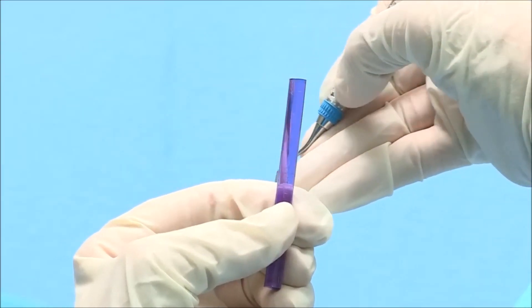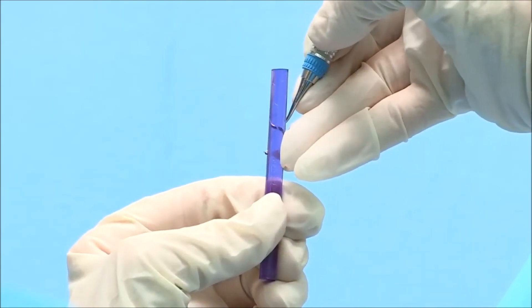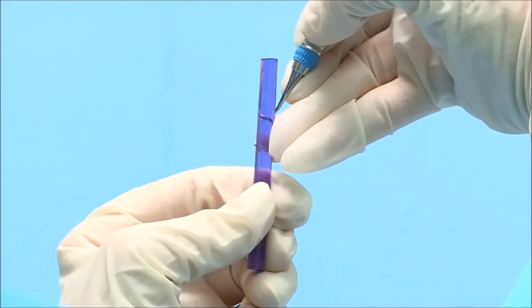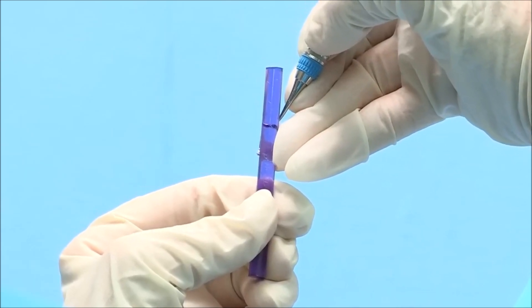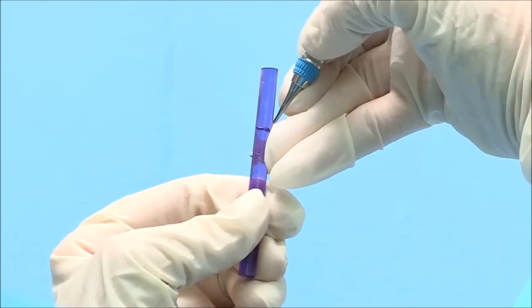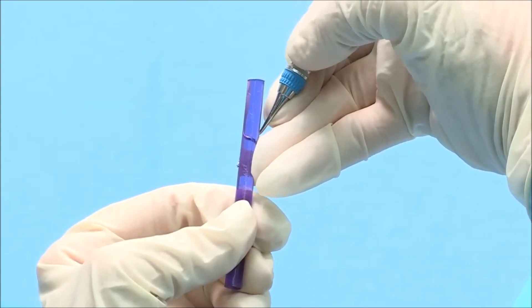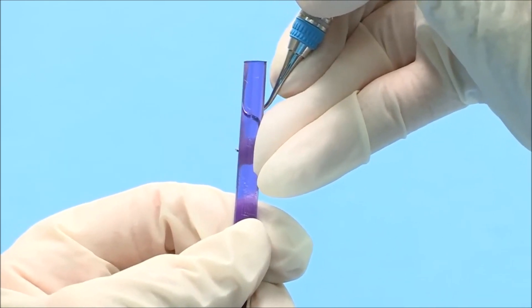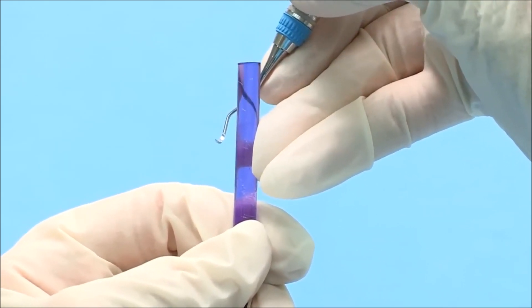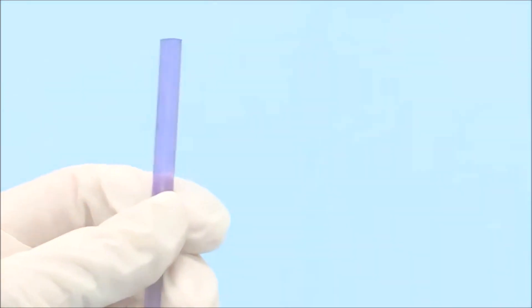Bring the instrument behind the test stick and place the cutting edge against the left side of the stick. Place your ring finger against the side of the test stick opposite the cutting edge to act as a fulcrum while testing. Press the cutting edge into the test stick and release. If the instrument is sharp, it will bite or grab the test stick. You will also hear a metallic sound or ping when the instrument is removed. Be sure to test the entire length of the blade.